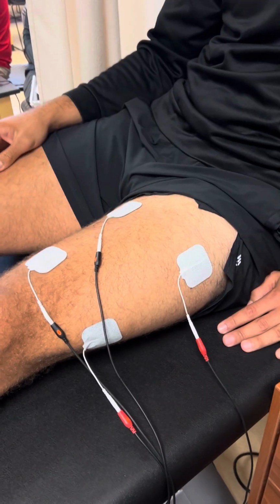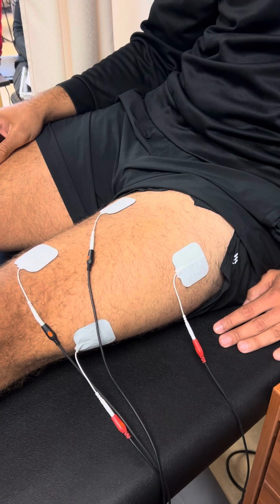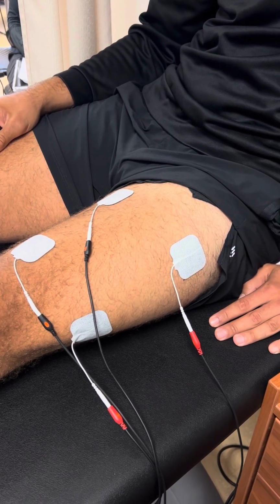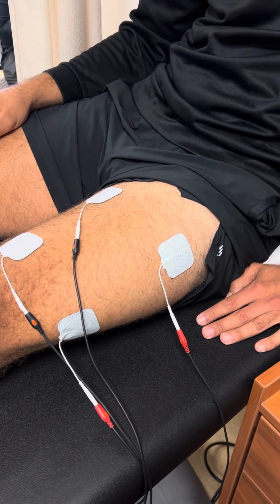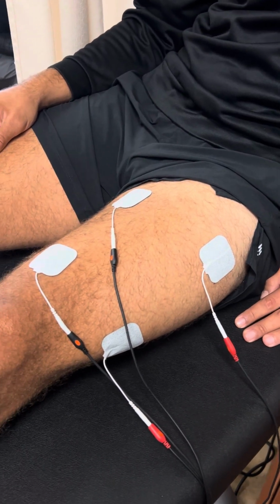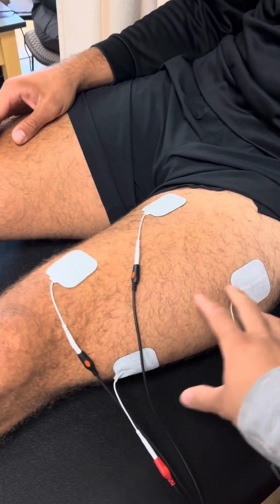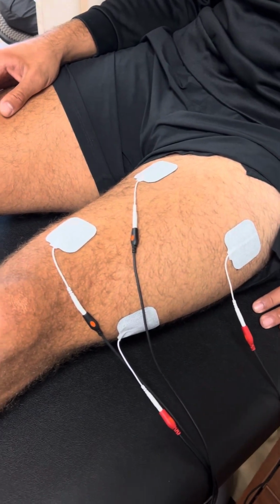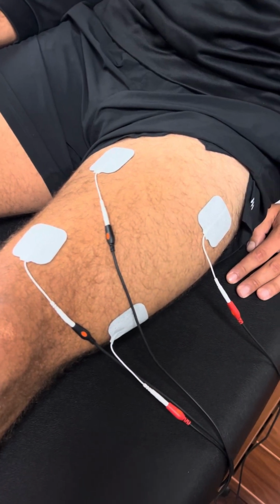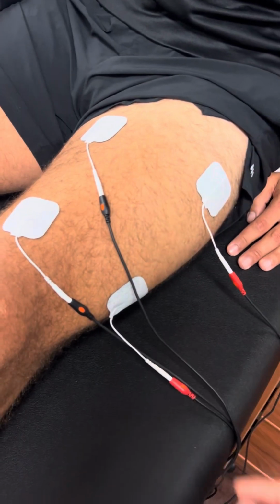For some of the parameters, for our timing of application, we're going to do this for the acute phase for swelling reduction and edema control, and then before rehab exercise to decrease pain and increase range of motion. So when we're doing the modality, I have the 4 pads already lined up on the patient in a cross-sectional crisscross way, this way and this way.